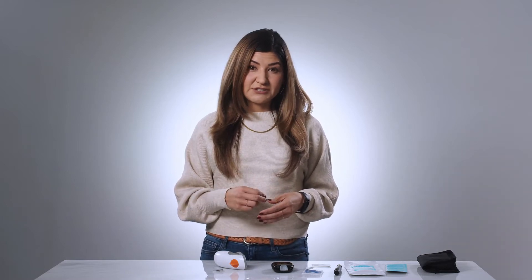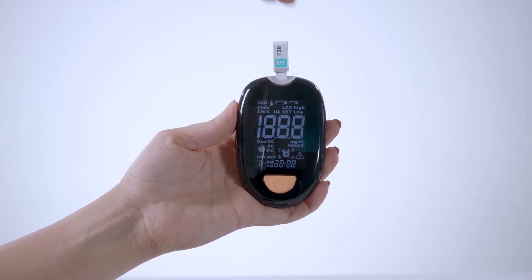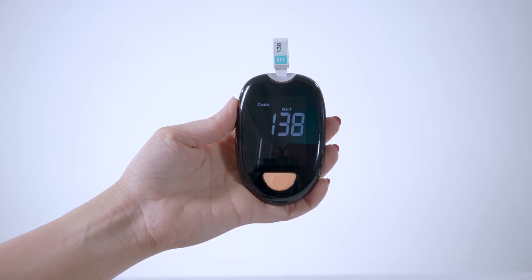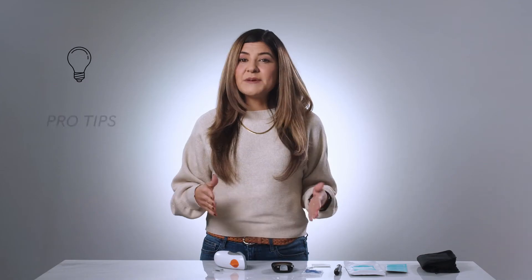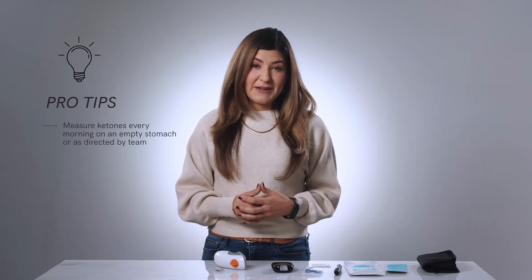The next step is to calibrate the ketone meter. Making sure the meter is off, locate the control strip that is attached to the strip of test strips. Insert the control strip into the top of the device, ensuring that the numbers on the control strip and the orange button are both facing you. Once inserted, the device will turn on and begin to calibrate. Once complete, you'll see a number on the screen that matches the number on the control strip — your device is now ready for your first reading.